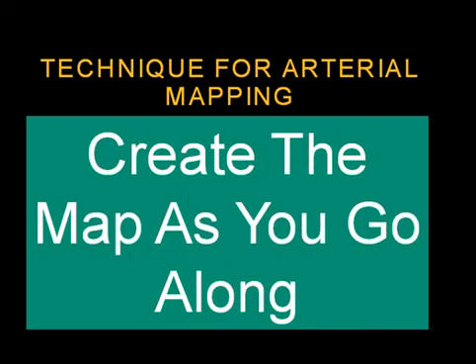Very important is to create the arterial map as you go along. This is not the kind of study that can be easily reproduced at the end of a day after you scan 10 or 12 patients or so. There are just too many details to recreate at the end of the day. And so what we do is we create the map segmentally as we evaluate the aorta to the aortic bifurcation. We would then go and create that map, evaluate the iliacs and create the map of the iliacs, then go on to the femoral popliteal segment, and then onto the tibial artery, scanning one tibial artery at a time and creating the map as we go along.